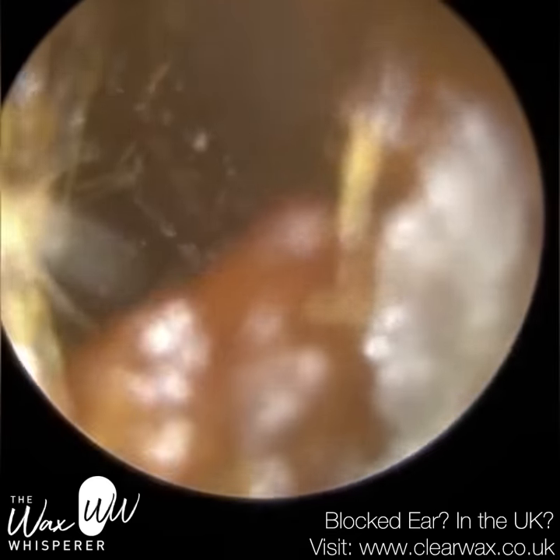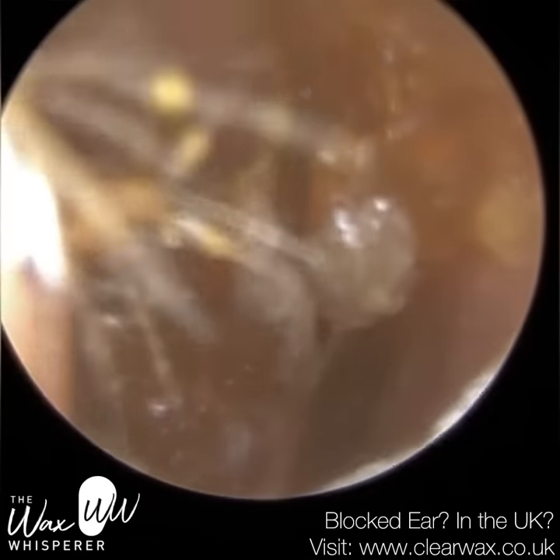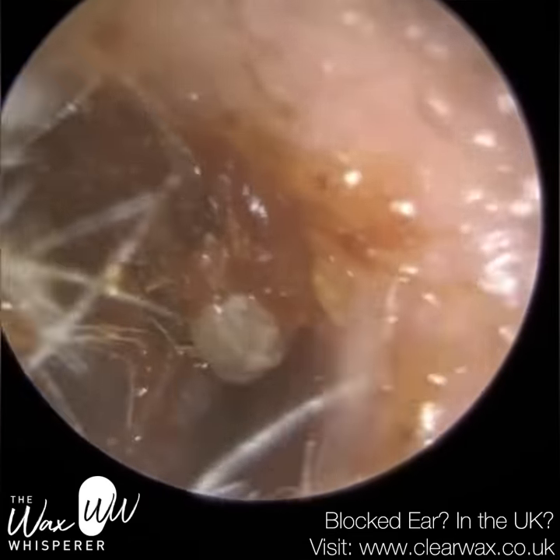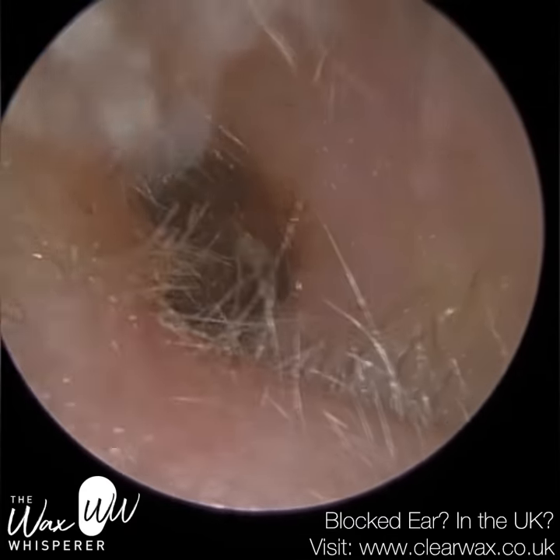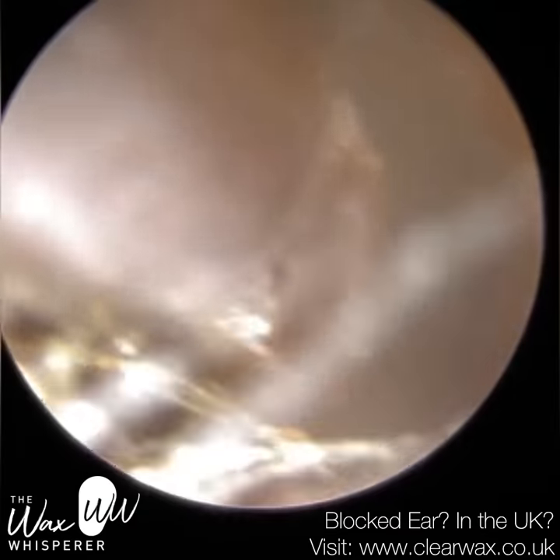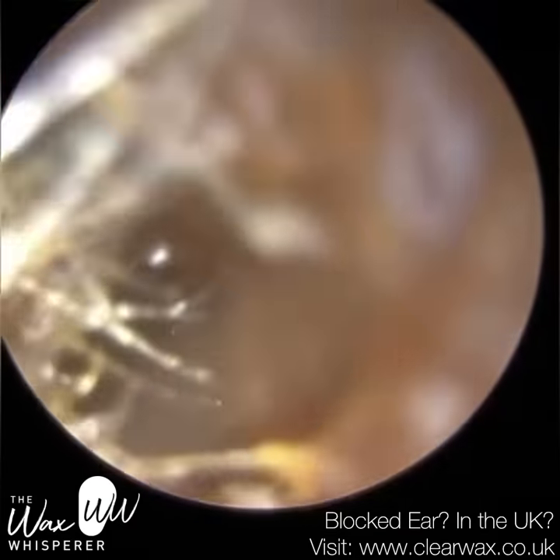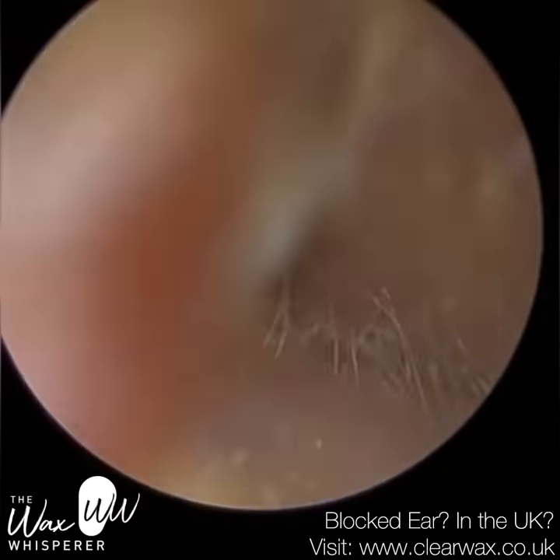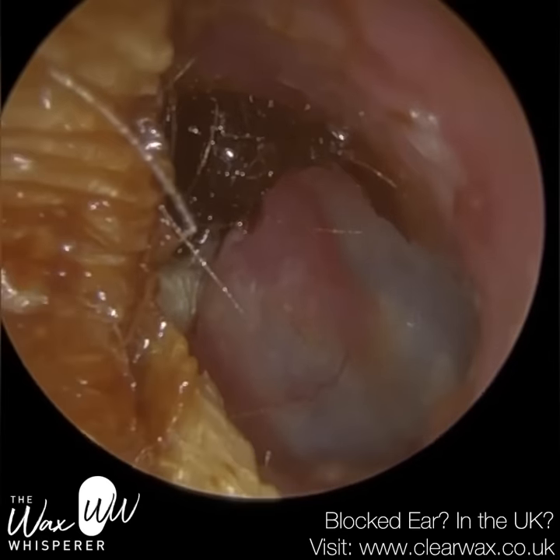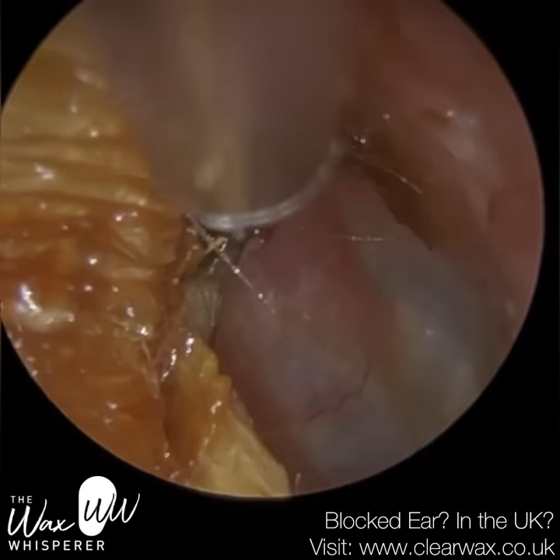I was a bit worried that the fine end wouldn't be strong enough to remove this wax off the drum, but as you can see I managed to extract it. Now it's just a case of removing it out of the ear because it's such a narrow ear — I think I'm going to use the bigger suction probe here just to do that. And instantly, as soon as I removed that particular part of wax from the drum, the patient noticed an instant improvement in their symptoms — and just as well, because this weekend they had a lot of family visiting and they were worried they wouldn't be able to hear and engage in conversation.